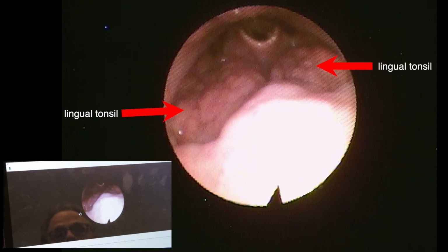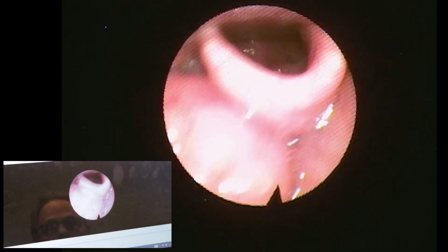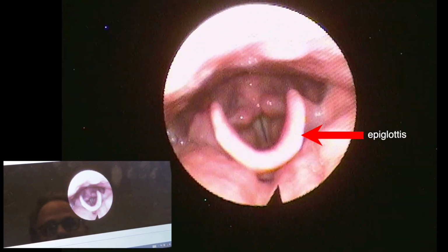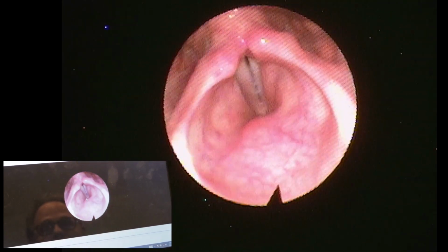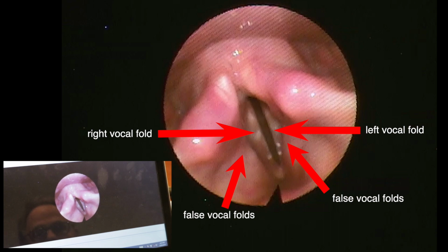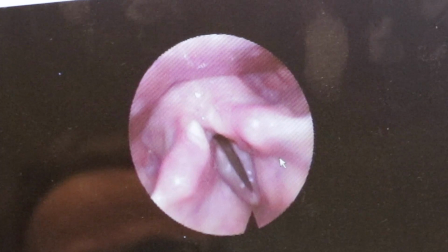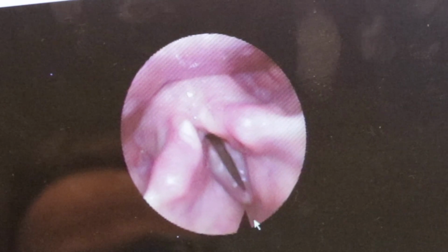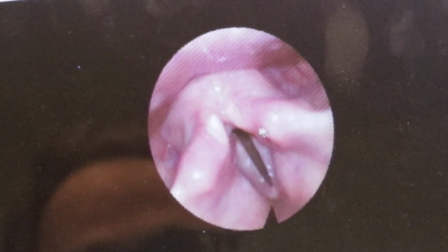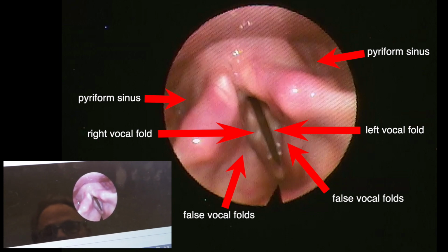These would be the lingual tonsils, which we'll look at in just a little. Okay, and then we're looking at epiglottis. And you're gagging. Okay. Epiglottis. It's the horseshoe. The horseshoe, yeah. True vocal folds, false vocal folds, and false vocal folds here and here. And then the epilaryngeal tube extending about up to here. We call it the petiole of the epiglottis. So right around in that area. These are called piriform sinuses. Because most people associate their sinuses a little higher up, yeah? Right.